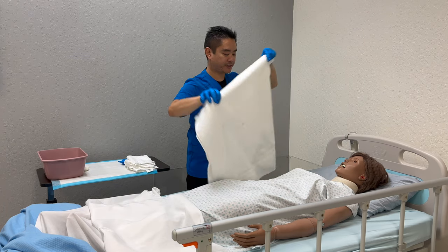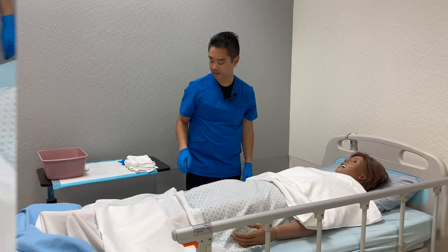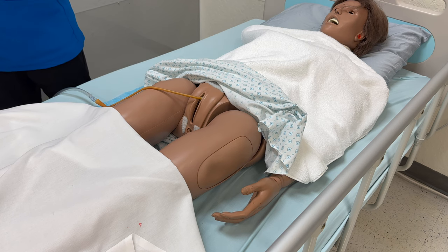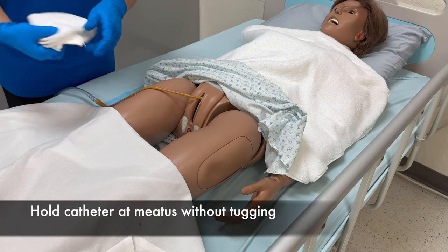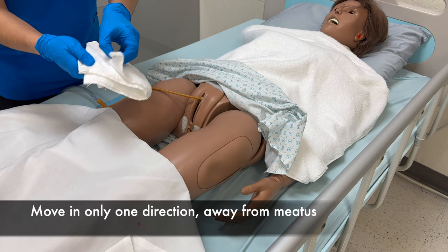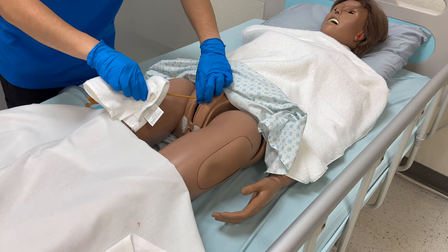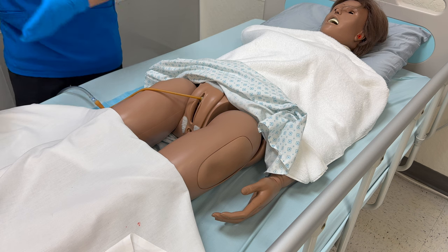I'll place a towel over your chest. Only expose the area with the catheter and lower the linens between the hip and knees. I'm going to wet the washcloth and put soap on all the corners. We're going to clean from the meatus going outwards about four inches, using a clean corner each time. Get a second washcloth and rinse — again, without tugging — four inches away from the meatus. And the last washcloth to dry.